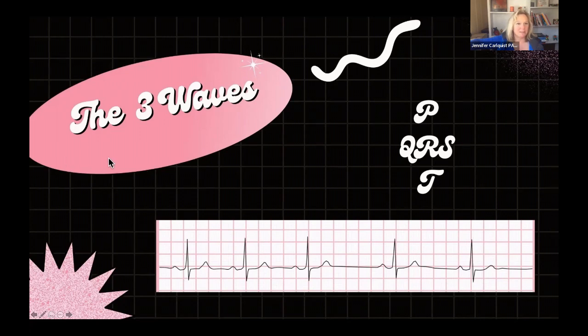So Timmy says wandering atrial pacemaker. I absolutely like where you're going with that, because the P waves are different and it is irregular. But Chris, yes, this is actually a sinus arrhythmia. This was a hard one. And Timmy, I love where you're going with that because the P waves look a little bit different. But it's a sinus arrhythmia.